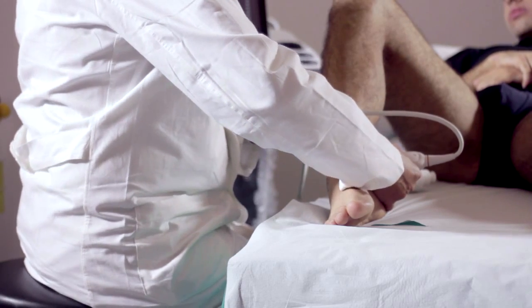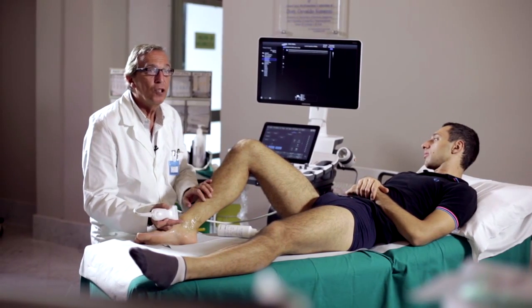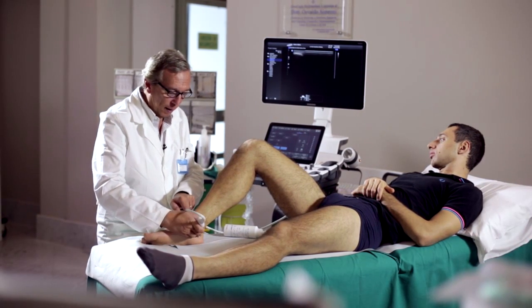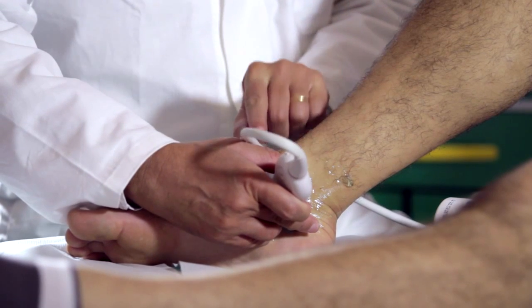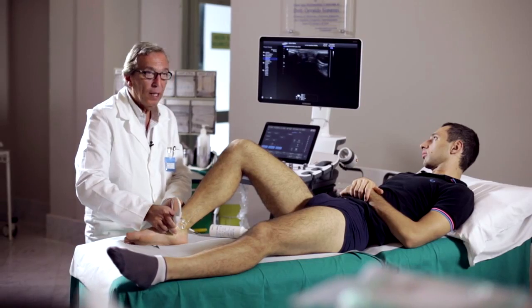Another important structure is the medial ligament component, which is represented, as you know, by the deltoid ligament. The ultrasound allows the study of the three main components of this ligament, known as its three main beams. By doing scans from the apex of the posterior tibial malleolus, we are going to study the tibiotalar rear beam. If we scan in the middle, from the apex of the tibial malleolus, we can study the tibiocalcaneal bundle, and finally, the most anterior tibiotalar bundle.